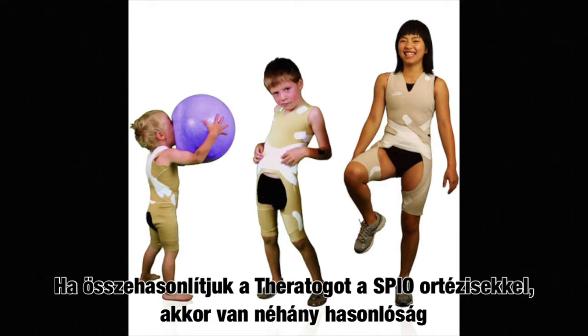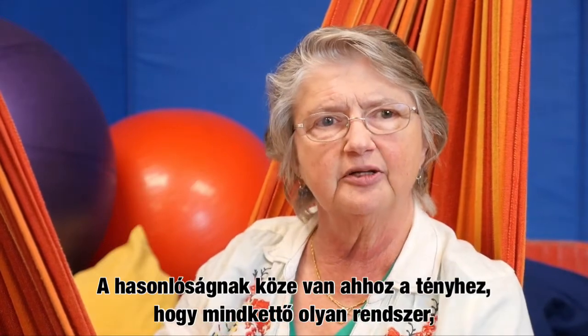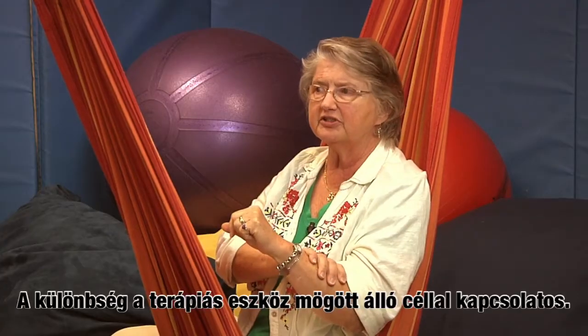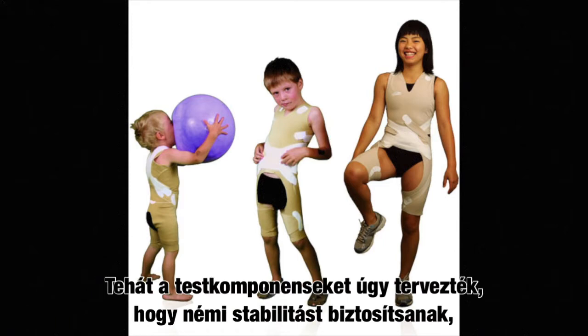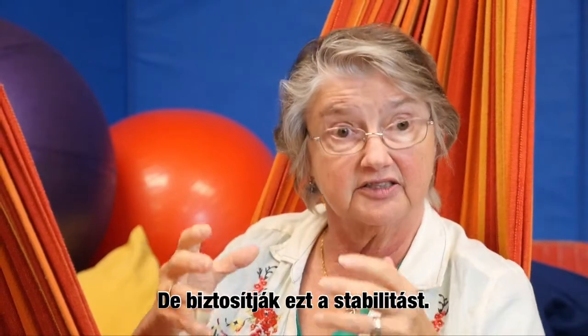When we compare Theratogs to Spio orthotics, there are some similarities and a number of significant differences. The similarity has to do with the fact that both are systems based on some deep pressure compression. The difference has to do with the objective behind the therapeutic tool. Theratog is designed as a stabilization and force-inducing orthosis. So the body components are designed to give some stability, and they restrict motion much more than Spio, but they do provide that stability.